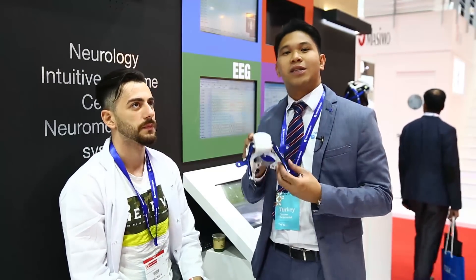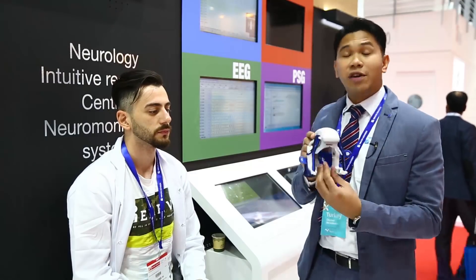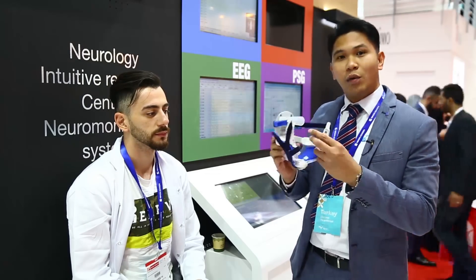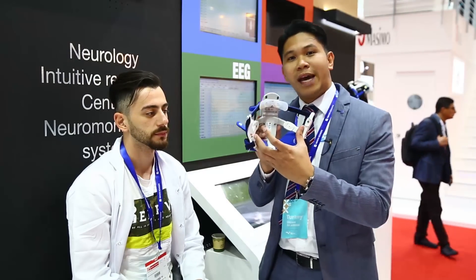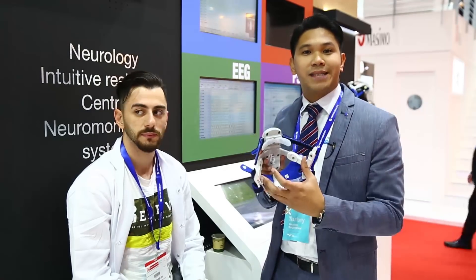Today we will discuss the latest and revolutionized technology on the EEG headset. As you may know, one of the difficulties in EEG monitoring is the attachment of the electrodes. But right now, with this type of headset, we can do the monitoring of the EEG within five minutes.